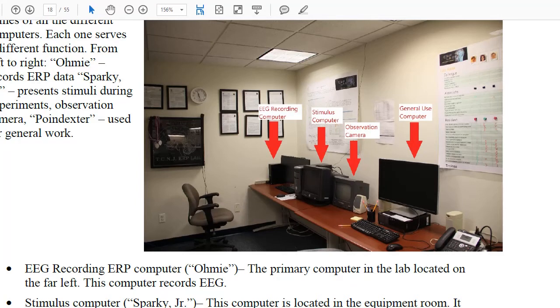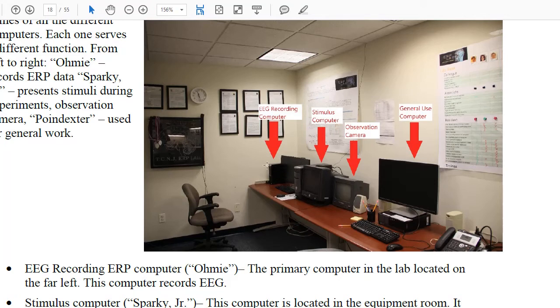This image from your manual shows you the EEG recording computer. So this is the computer that records the EEG that's coming from the amplifiers. It's all the way to the left on the desk. Next to it is the stimulus computer.